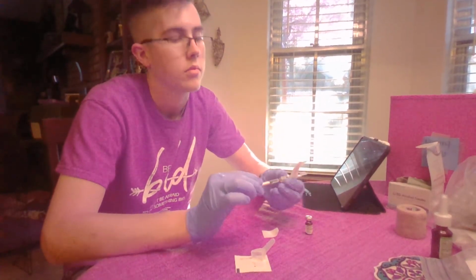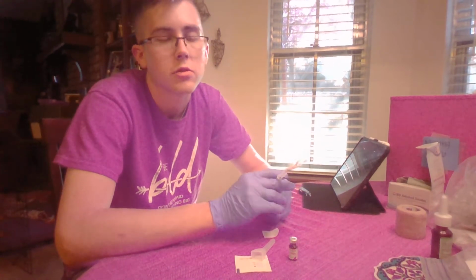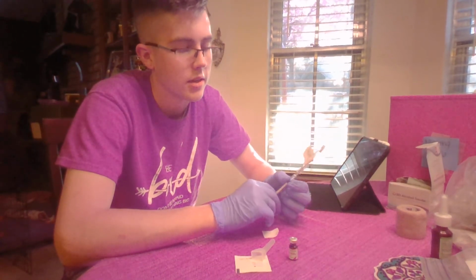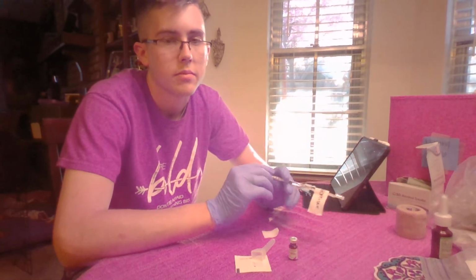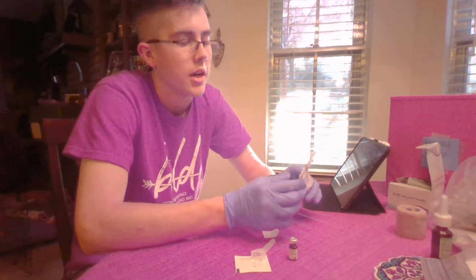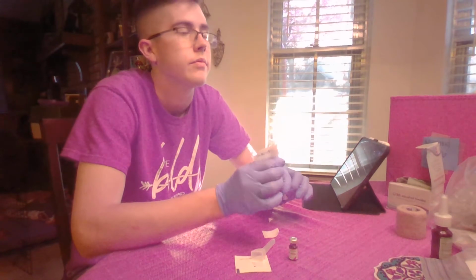Put on my atomizer. Then I will cease any form of ventilation. I will inspect the nostrils to see which one is largest, as well as has the least blockage. I will then insert the atomizer into that nostril. I will then insert the medication briskly. I will put all of this into the sharps container, resume ventilation, and then monitor my patient for any undesired side effects.